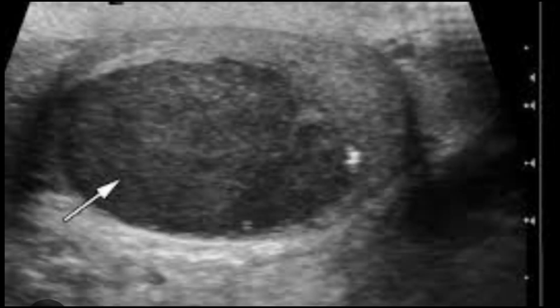Predominantly it is hypoechoic, and there is no cystic component seen in it. There is no fluid debris seen in it, and this is occupying two thirds of the testes. So this is another example of the seminoma. It will appear like that, and it will be a uniformly hypoechoic lesion.